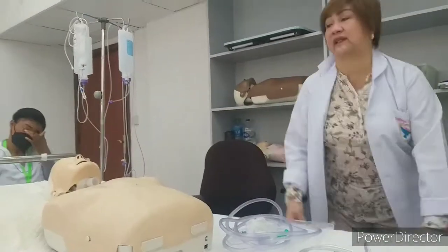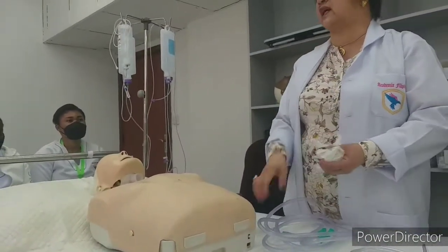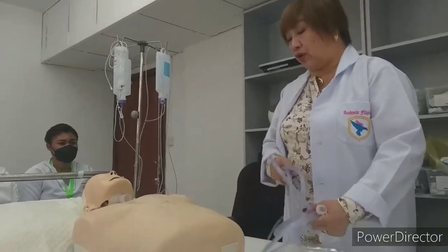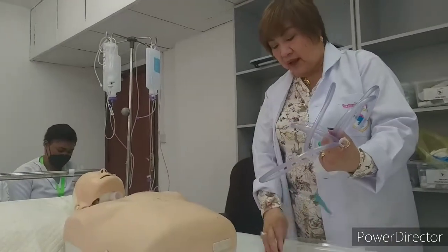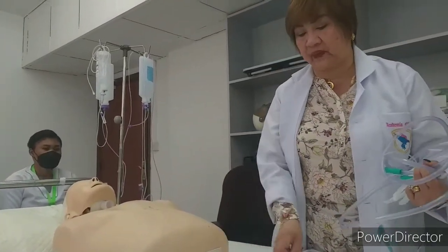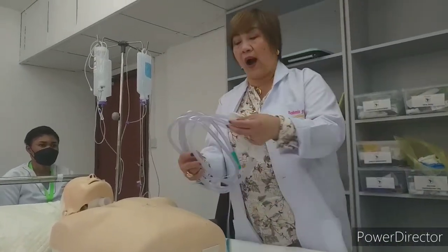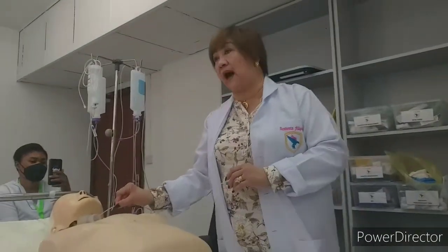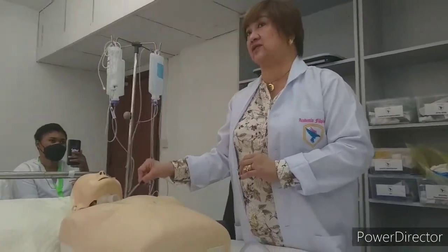We will not wait for the nurses, or talk to your nurse or inform your nurse that the patient needs to be suctioned. Upon your assessment, you need to suction your patient. Now, suctioning. What is suctioning? So you got it? It is the aspiration, or cleaning, withdrawing of secretions from the patient's mouth, the nose, and the trachea.